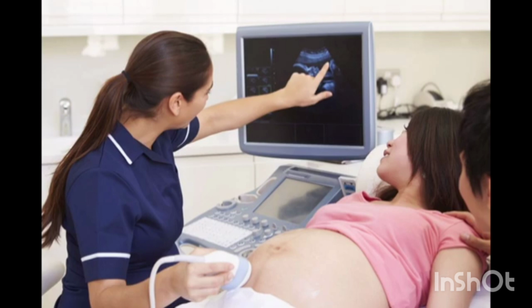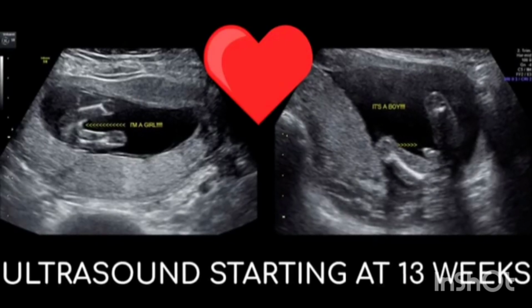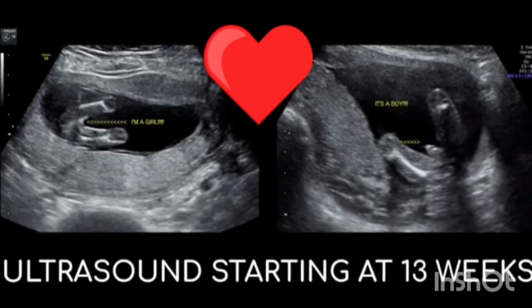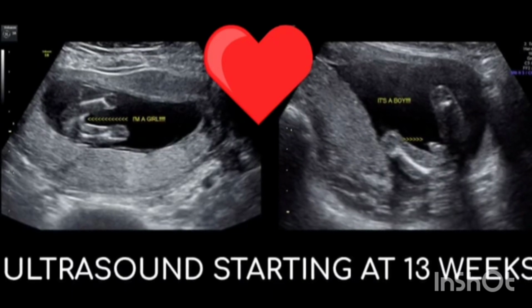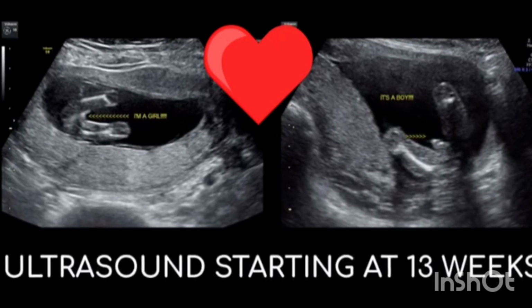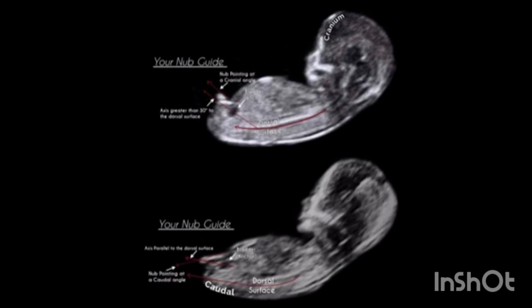Ask the technician to show you what they are looking at. If you say you want to know the gender, the technician will be happy to tell you. However, you'll need to make it clear that you don't want to just know the results, you want to understand them. You can say something like, "Can you show me exactly what indicates the gender? Can you explain to me how you can tell? I really appreciate it."